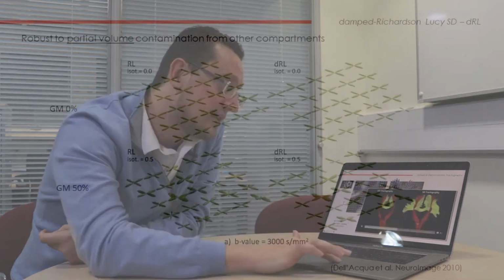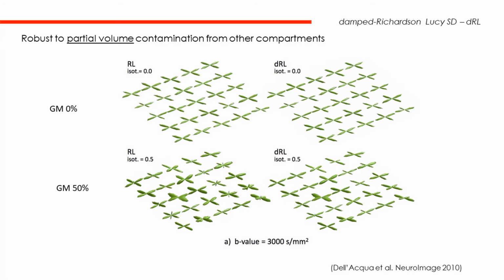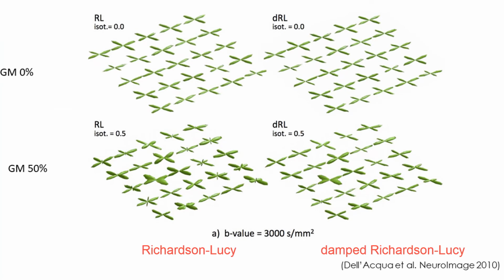Okay, so one thing I want to mention is that there are different methods to do spherical deconvolution. What we did in our lab was to look not at the general case with only healthy fibers and simple crossing. We were really interested in what happens, for example, when you have partial volume with gray matter, or contamination with edema, like in pathological tissue. We found that most methods are in trouble when there is contamination in the signal, when there is a signal of the white matter plus something else. So with our solution, we tried to develop a particular regularization that can take care of this contamination and still give you quite reliable fiber orientation estimation.